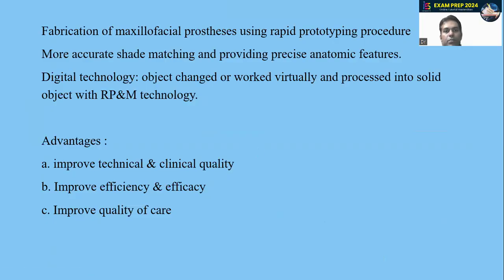Fabrication of maxillofacial prosthesis using rapid prototyping procedure. More accurate shade matching and providing precise anatomic features is possible by the CAD CAM technique. With digital technology, objects change or work virtually and are processed into a solid object with RP and M technology. Now, regarding advantages, it improves technical and clinical quality, improves efficiency and efficacy, and improves the quality of care.